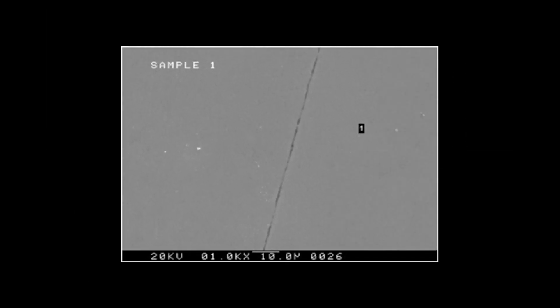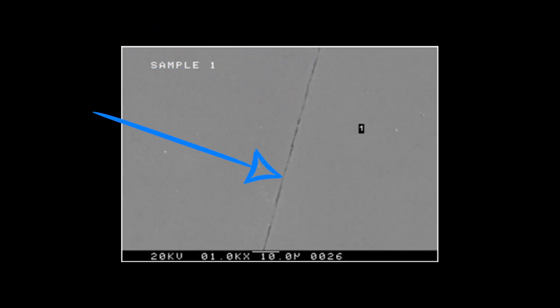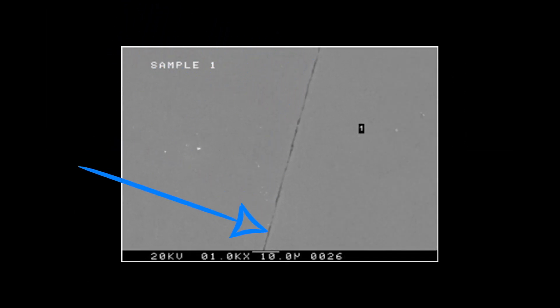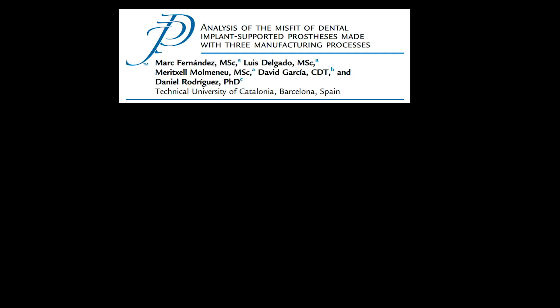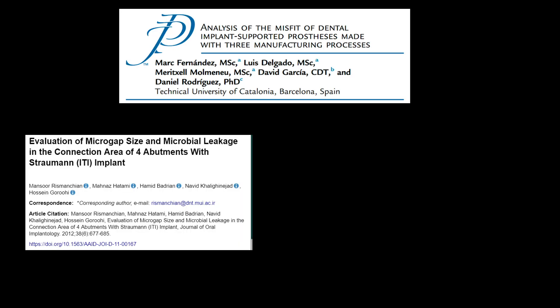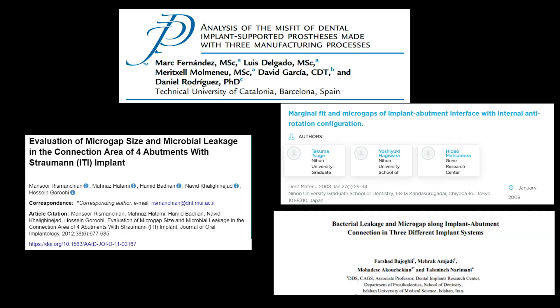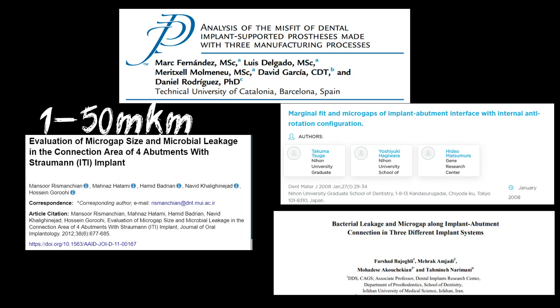Let's take a look at this photo. At 1000 times magnification, the gap is clearly visible, but it seems to be insignificant. Now let's magnify the photo and use the scale to calculate the approximate thickness of the gap. As you can see, the thickness of the gap is about 0.6 microns. Other independent studies show that the gap can vary from 1 to 50 microns.